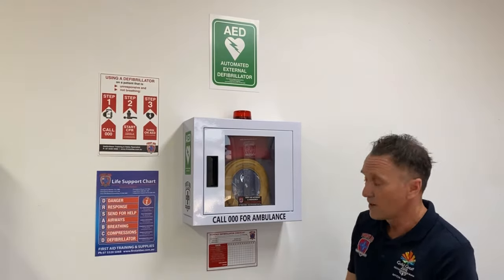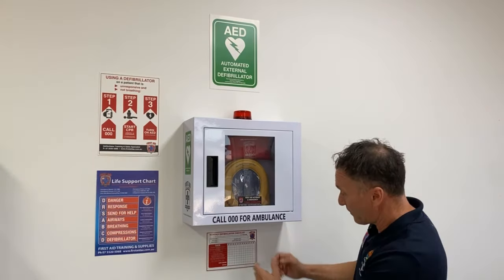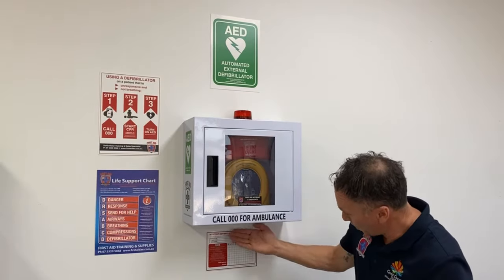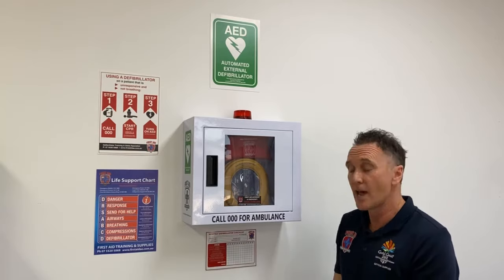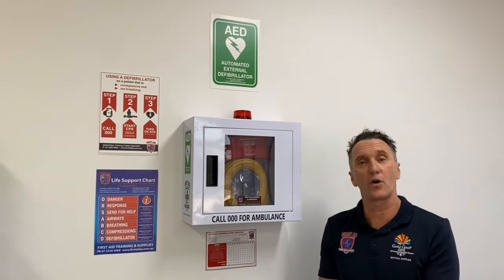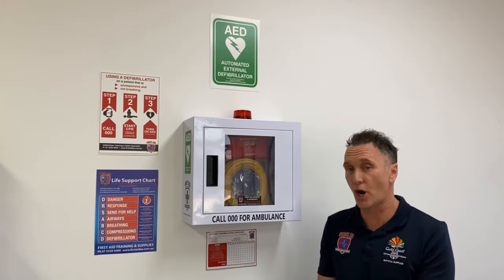Number two, for compliance as well, we have the monthly checklist, making sure that you're checking your defibrillator effectively for things like expiry dates and also to show that the indicator on the defibrillator is ready to go.